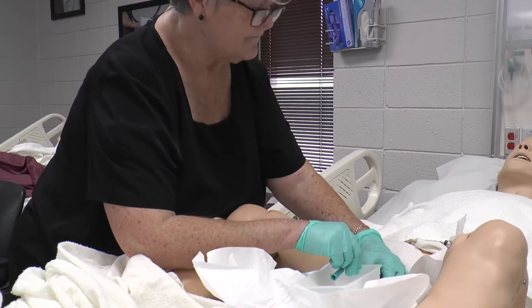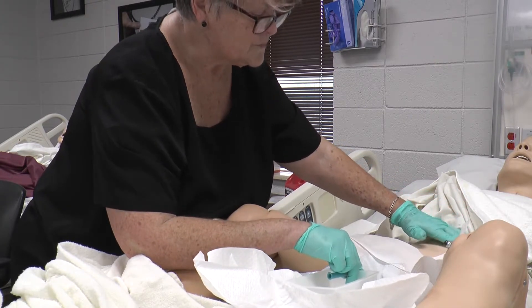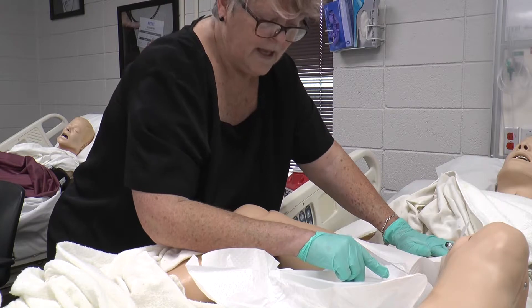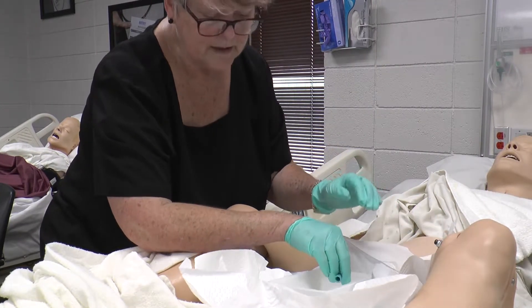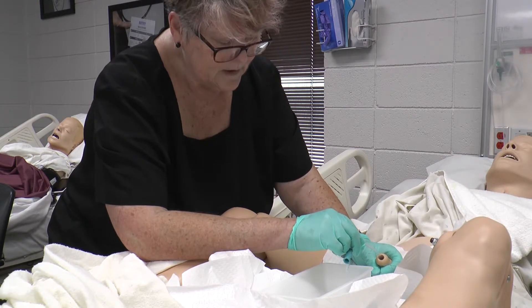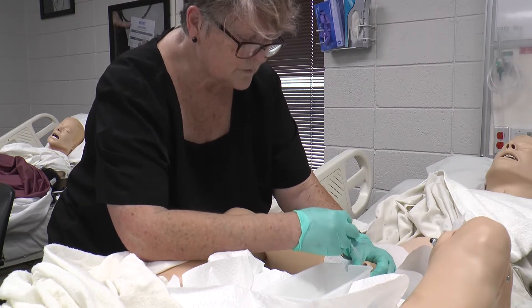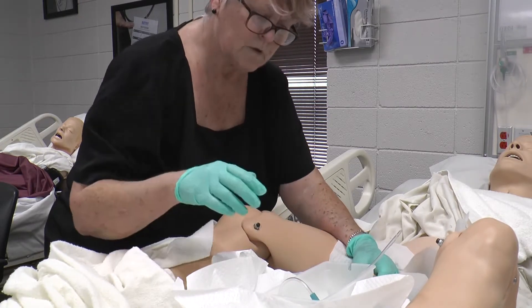Let his bladder drain. You can use the Credé maneuver — spelled C-R-E-D-E — which means pushing down on the bladder with your hand. This helps on both men and women to get the urine to come out better. If urine isn't coming, you can bring the angle of the penis up, swirl the catheter around, or raise the patient's head slightly. Once you have your urine, remove the catheter — boom, you're done.